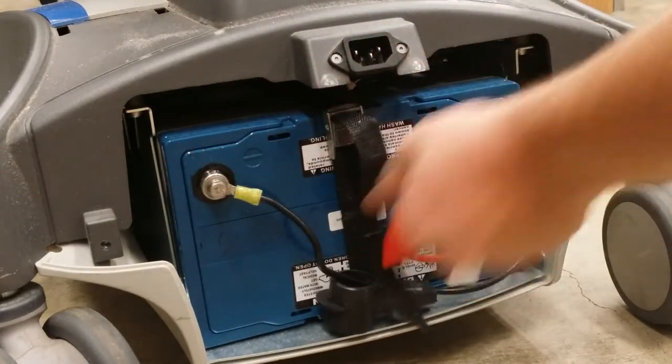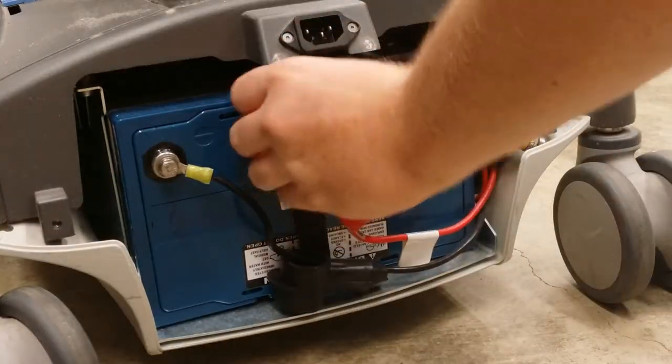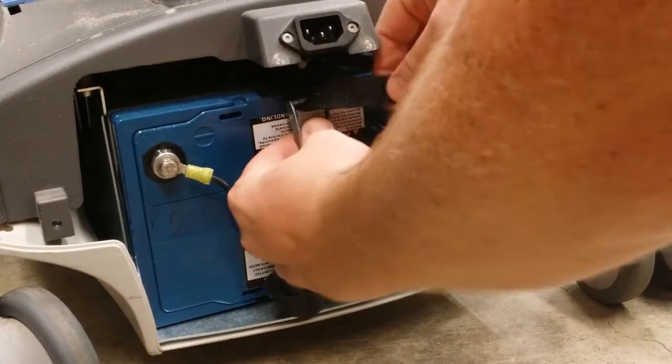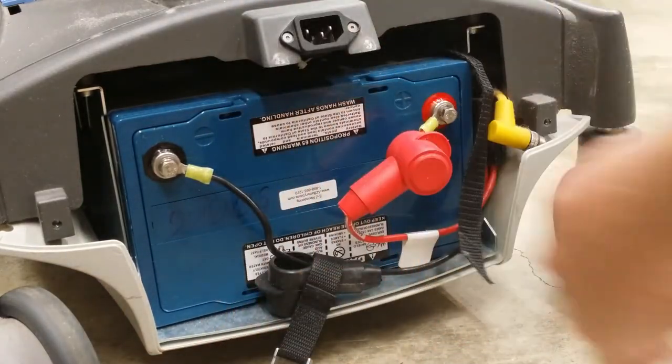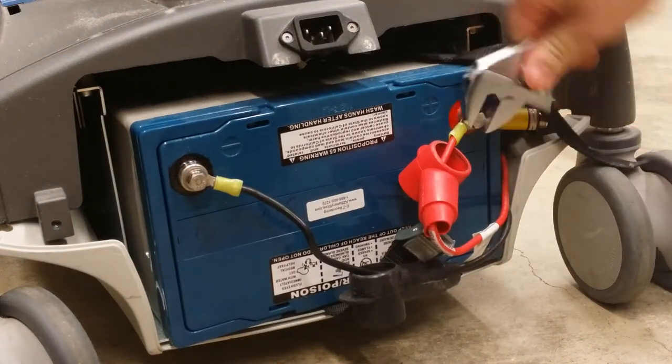Unstrap the battery and remove the rubber post protectors. Unscrew the positive and negative bolts.